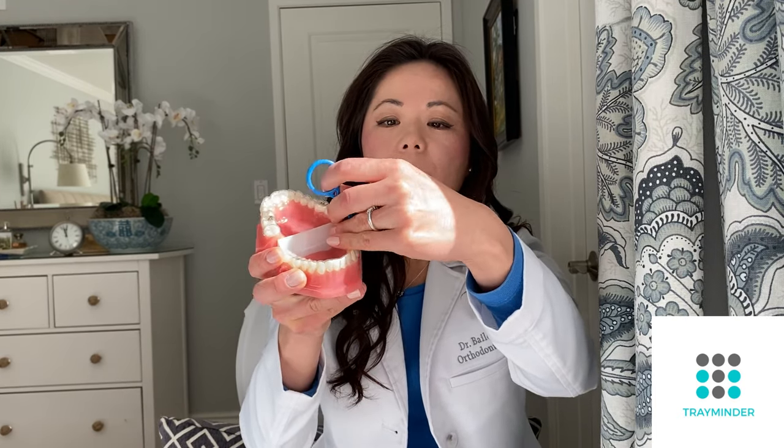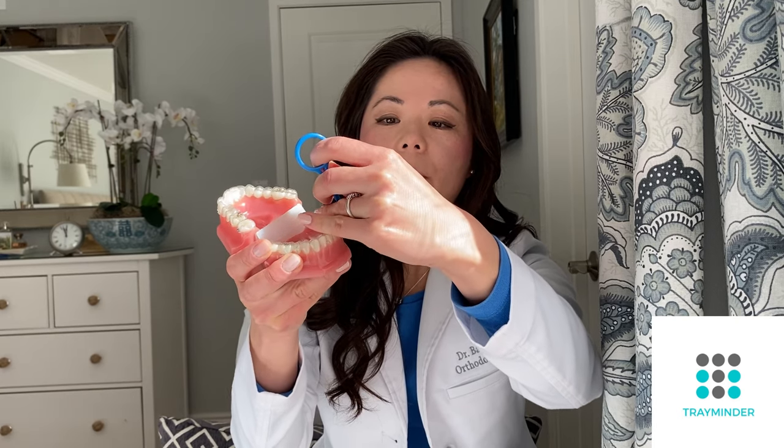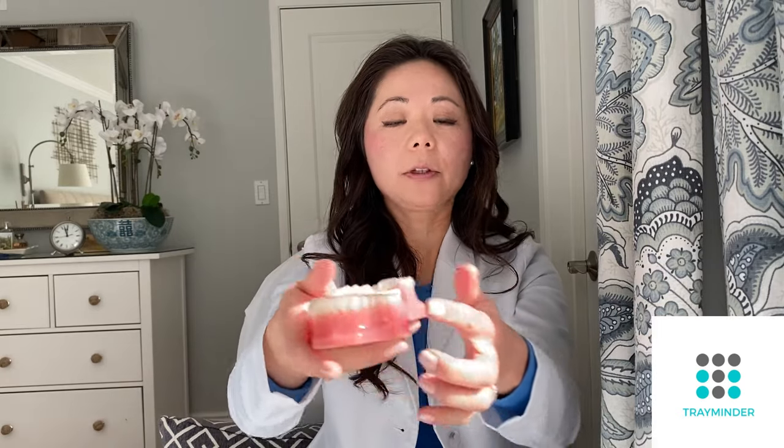On the bottom, remember from my previous video that you want to start from the outside. The reason is that your bottom teeth lean inward a little bit, so because they lean inward, you start from the outside and peel it upward. Start from the outside, peel upward on one side, then do the other side — pull it out and up and inward. Once you've loosened both back sides, go from the front and lift out and up, especially if you have a lot of crowding or attachments on the lower.